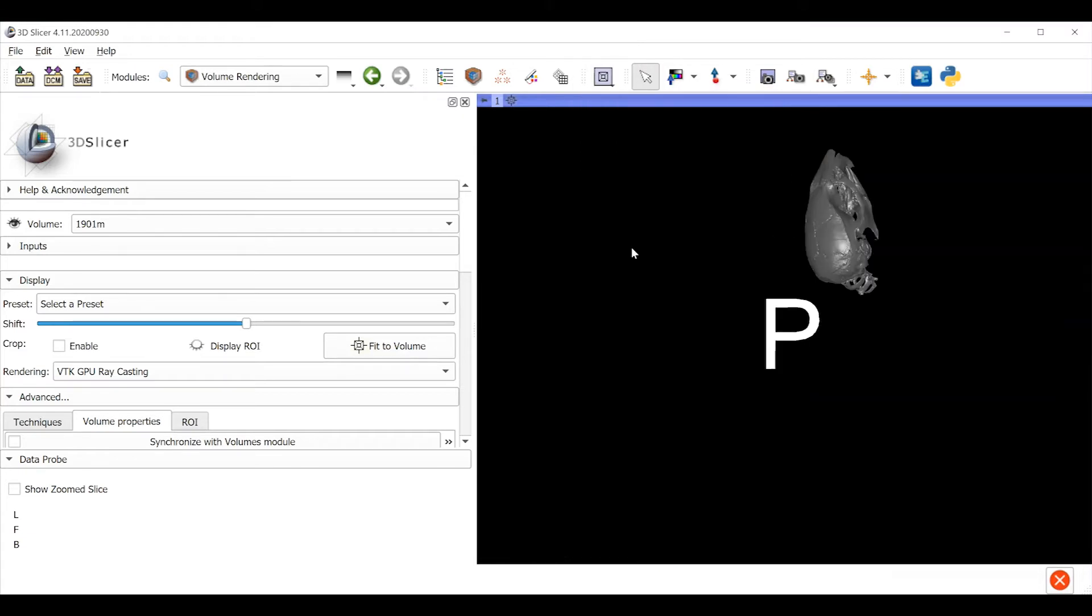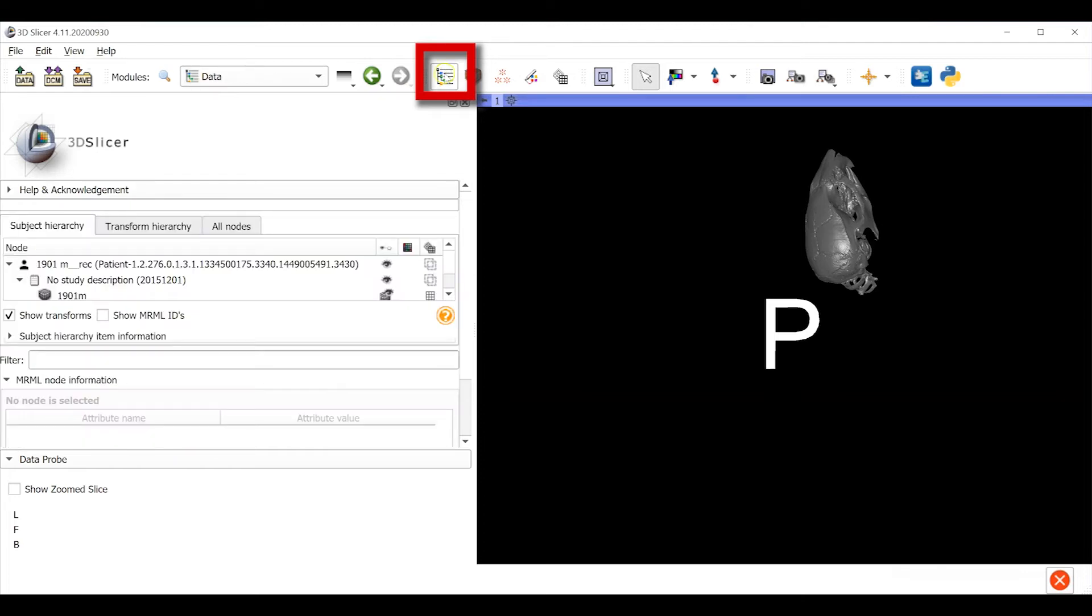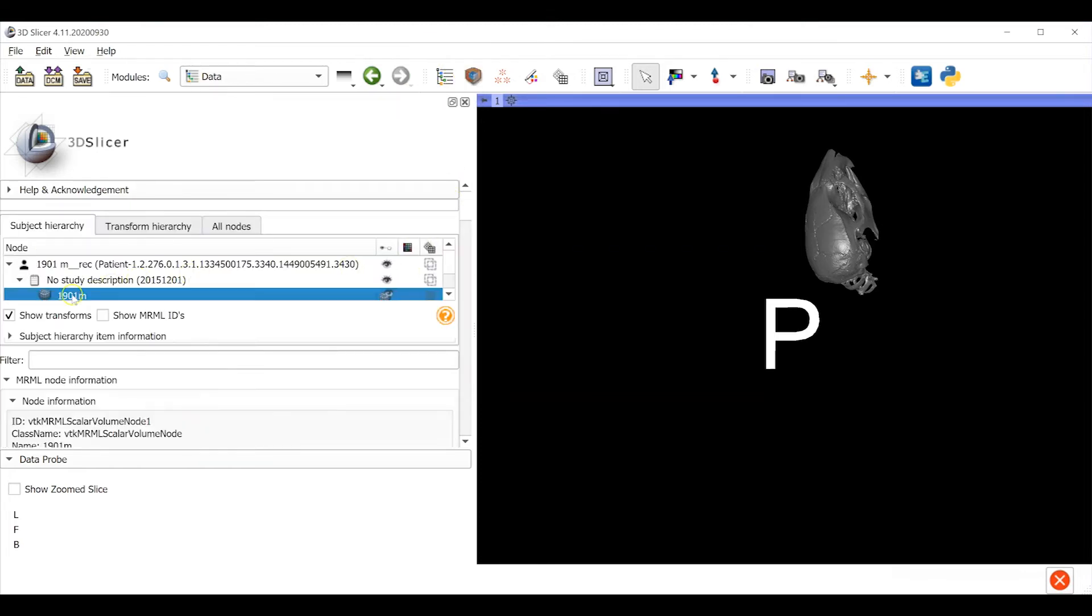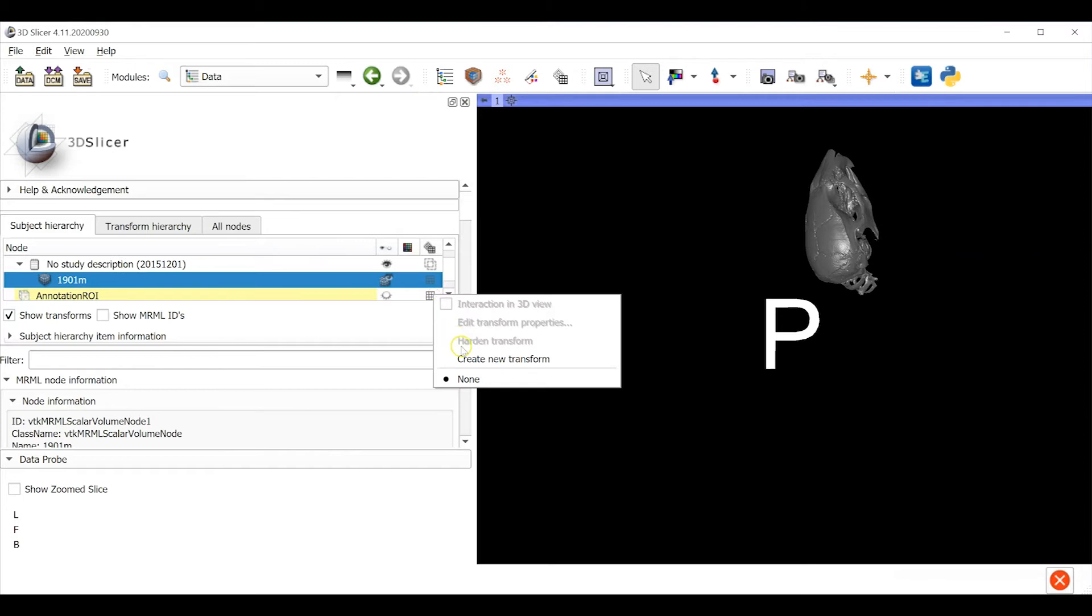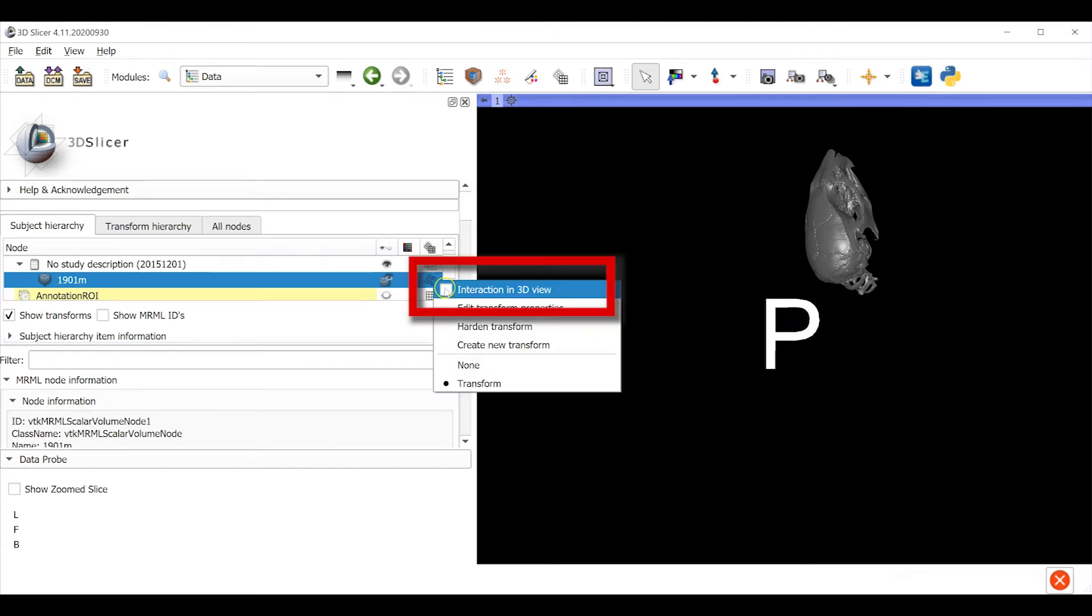Now this giant P in the background tells us that we're looking from what the computer expects to be the anterior direction towards the posterior direction. Notice that this mouse's head was scanned in a random orientation. We're going to fix that. We'll use the transform tool to do it. Now go to the data module and find the data object for me, 1901M. The transform tool is indicated by this grid icon to the right of the data object. Right click on the icon and choose create a new transform. Click on it again and activate the interaction in 3D viewer.